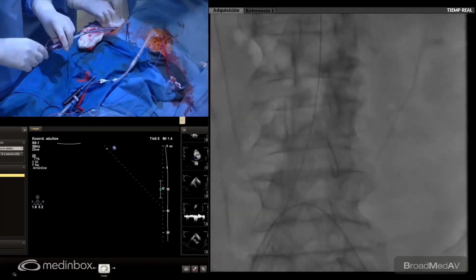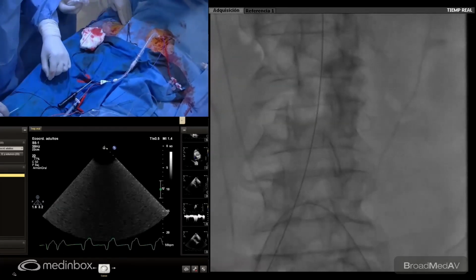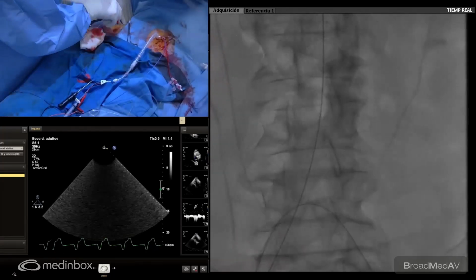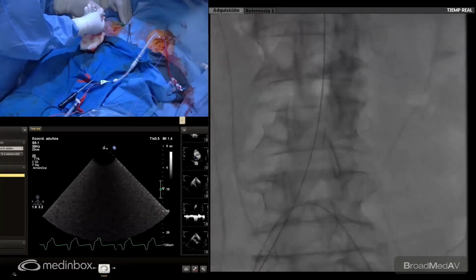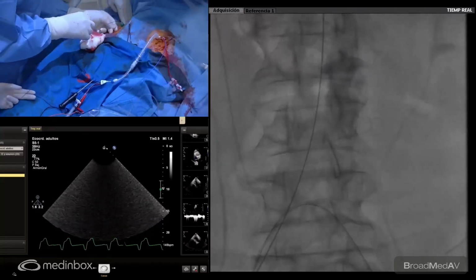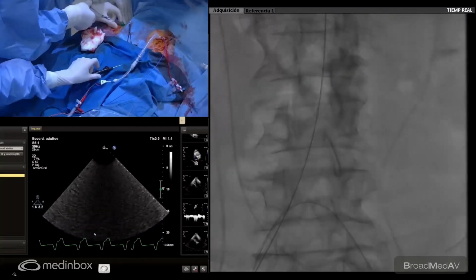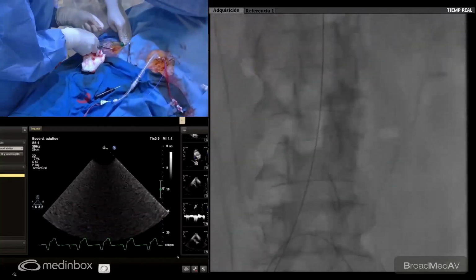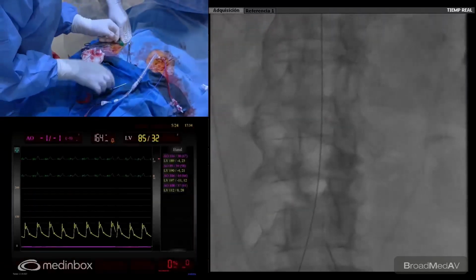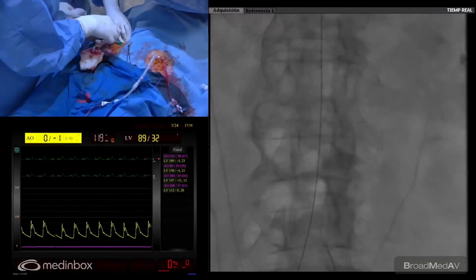Comprime, Carlos. You're scared about this closure because, yeah, I would say that the first thing to be answered here is how long we can wait to deploy the pacemaker. To be honest, I don't know. Probably until tomorrow.